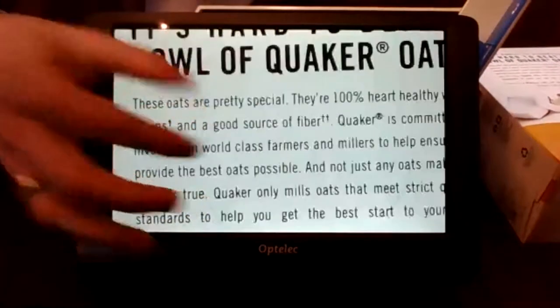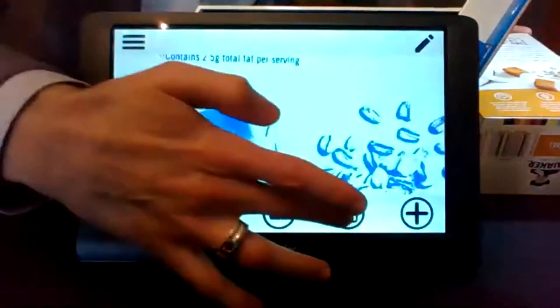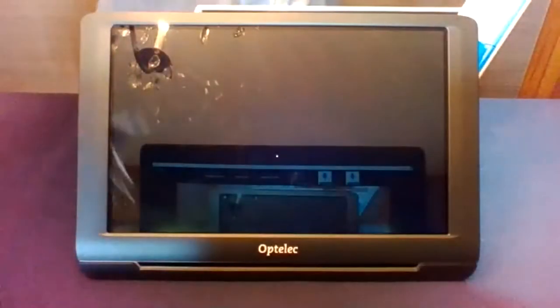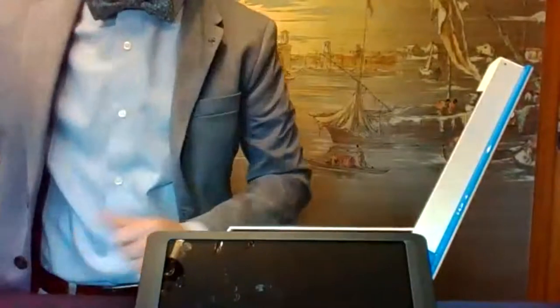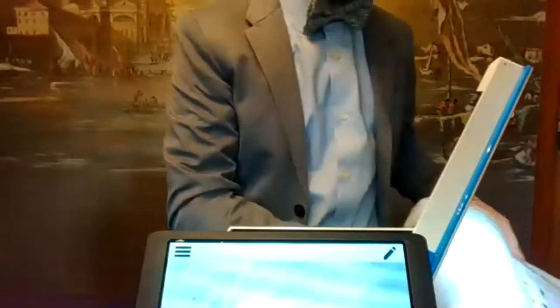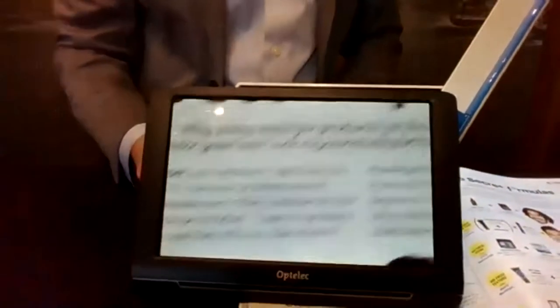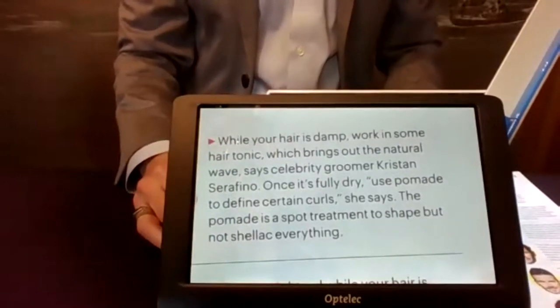Just to show another perfect case: here's a box. Under a regular video magnifier it would be difficult to fit that under there. With this, you've got plenty of space — just fit it under, zoom in, change contrast to read it, zoom in and out, snapshot it, and go back to live color. We've taken care to ensure that if you put something thick under there that significantly changes the focus depth, this device will still perform — it has enough tolerance to do the adjustment and still provide a crisp image of the text.